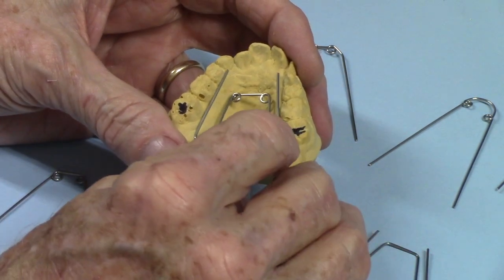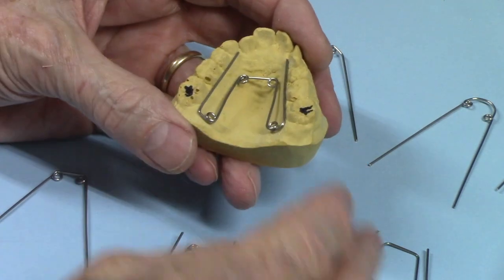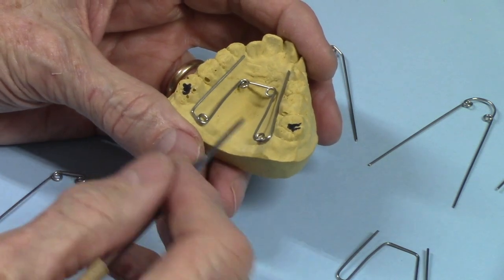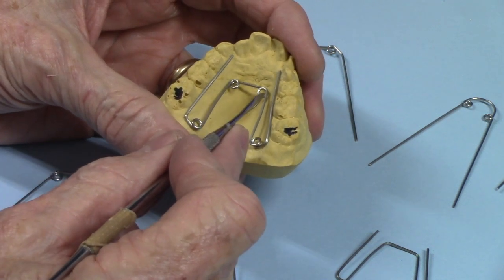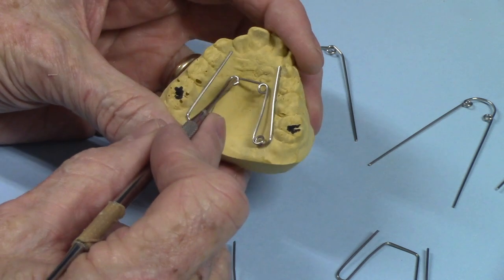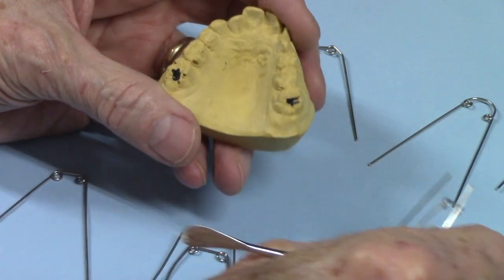Its primary purpose, or what it's most often used for, is for arch expansion. There are a few considerations. Let's break it down and talk about the interior component first. In the interior, these two helices are parallel with one another, and they have a bar that just goes straight across the interior. That's a very common design.